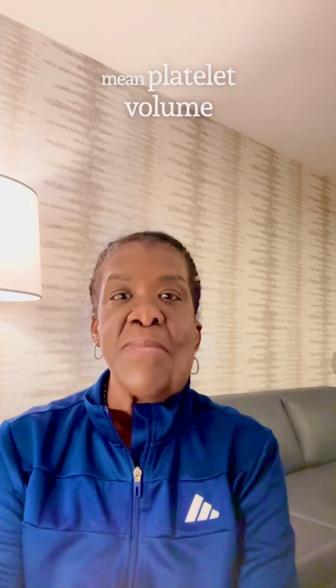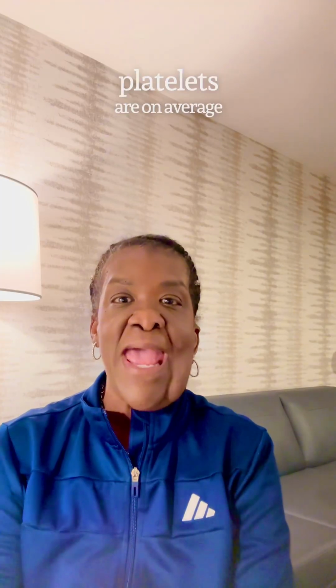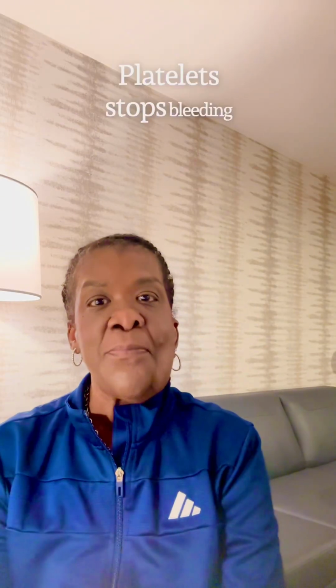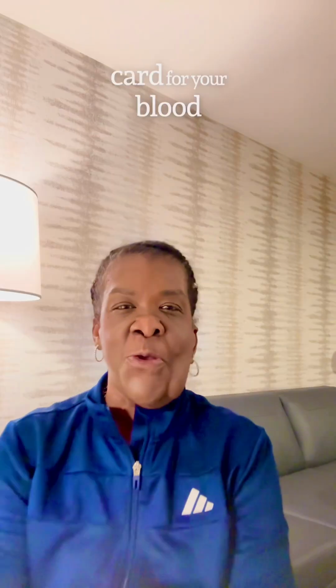MPV stands for mean platelet volume. MPV tells us how big your platelets are on average. MPV is the average size of platelets, like checking whether your body is making newer, bigger platelets or older, smaller platelets. So, to review, red blood cells carry oxygen. White blood cells fight germs. Platelets stop bleeding. Remember, a CBC with differential provides providers the information we need to address infection, anemia, immune health, and overall wellness. Think of it like your report card for your blood.